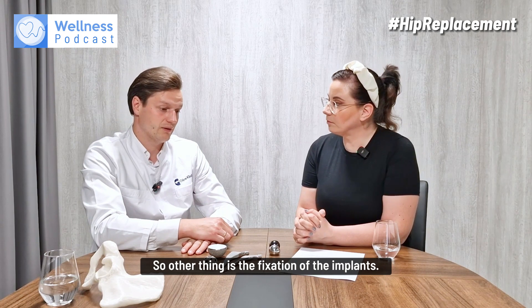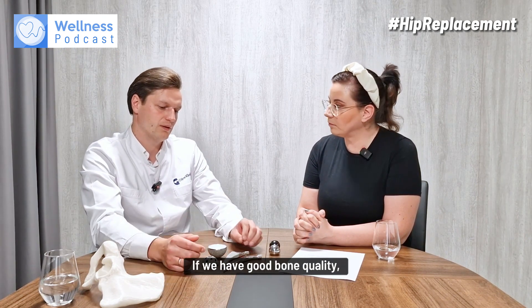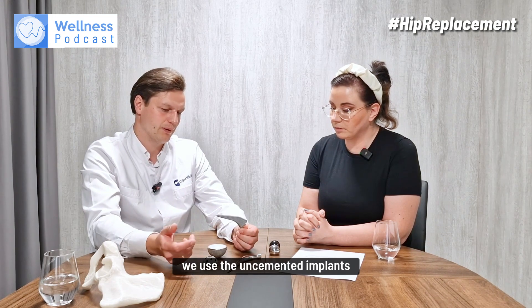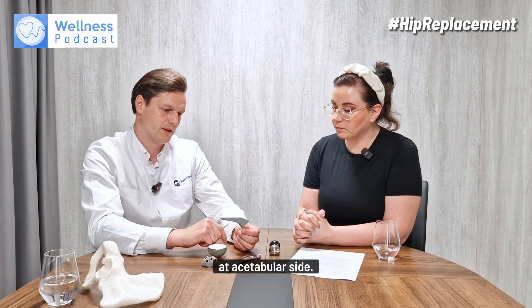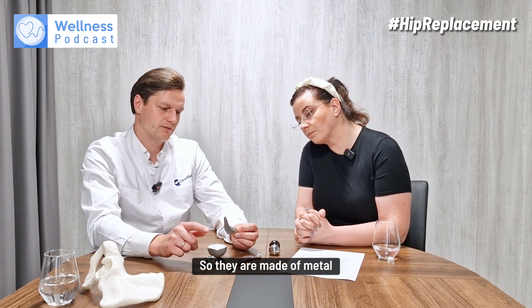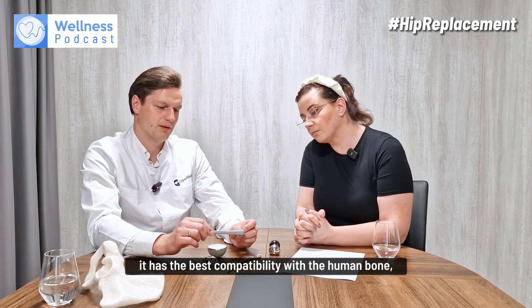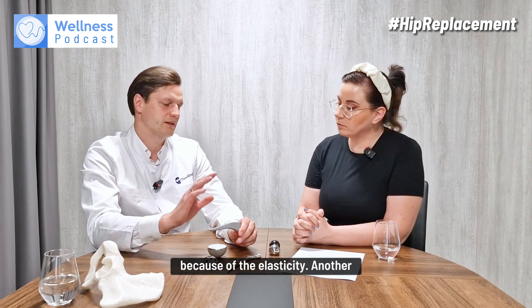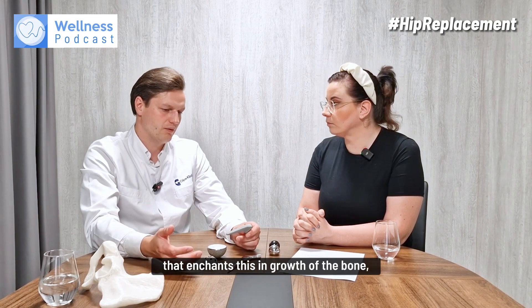The other consideration is the fixation of the implants. We have two types of fixation. If we have good bone quality, we use uncemented implants on both the femoral side and the acetabular side. They are made of metal — usually titanium — which has the best compatibility with human bone because of its elasticity and other technical properties. They are covered with a special material that enhances bone in-growth.